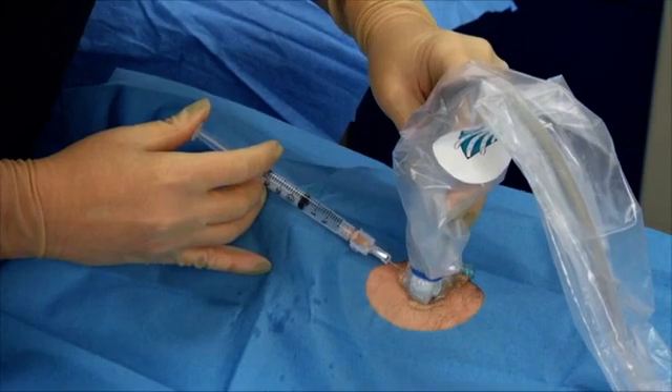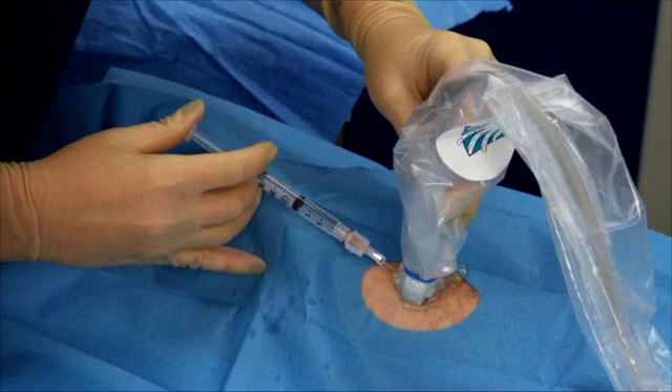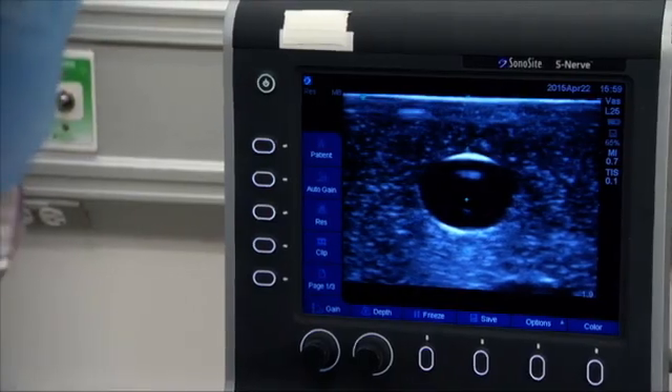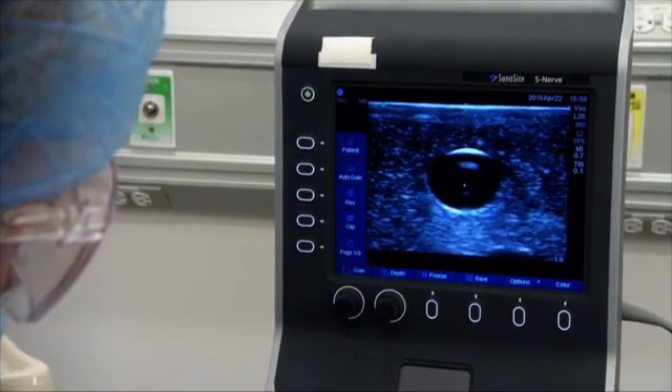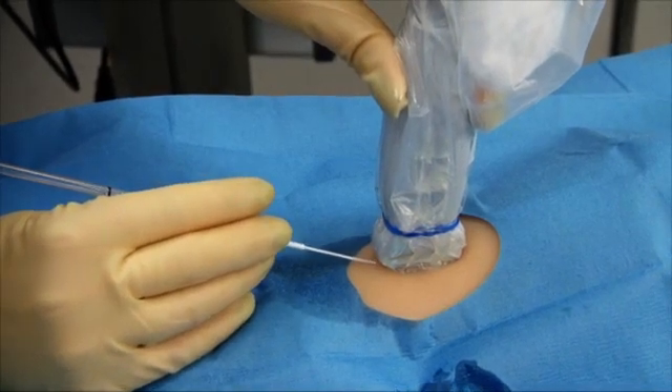Administer local anesthetic when indicated. Use the ultrasound when available to visualize infiltration of local anesthetic at the intended insertion location. Using the ultrasound, identify the artery. Puncture the vessel using a continuous, controlled, slow forward motion.